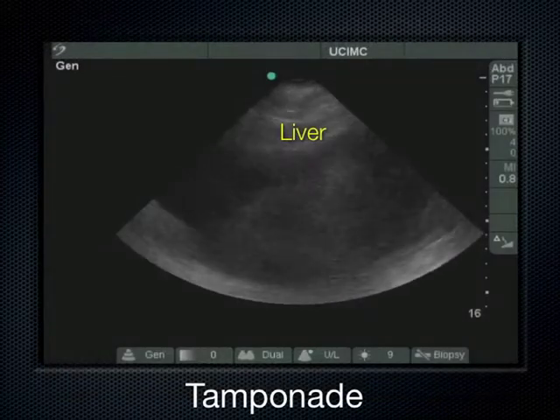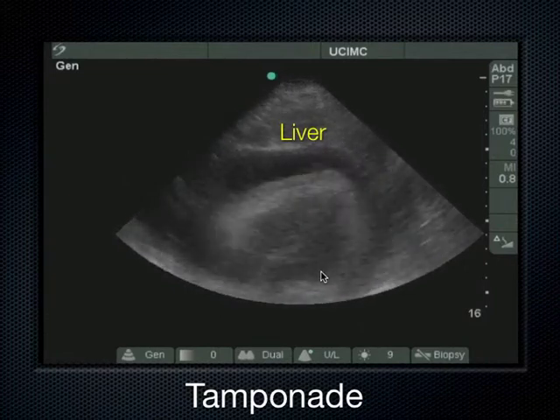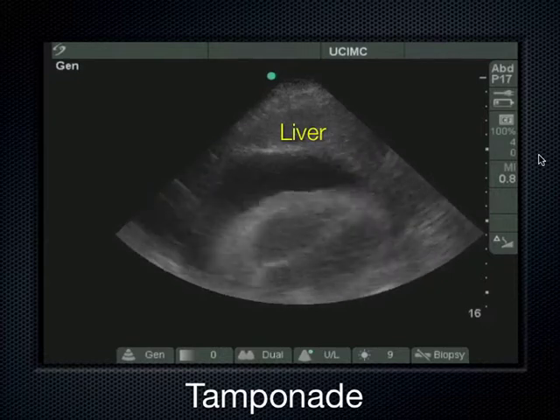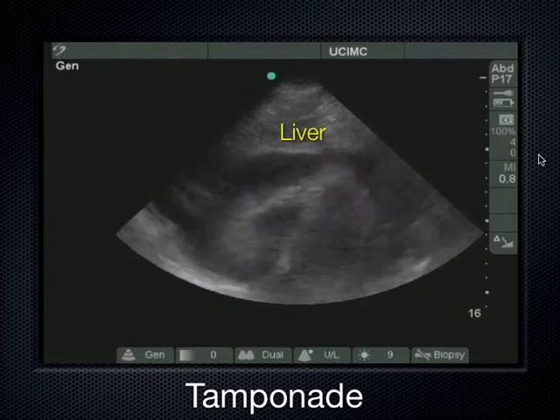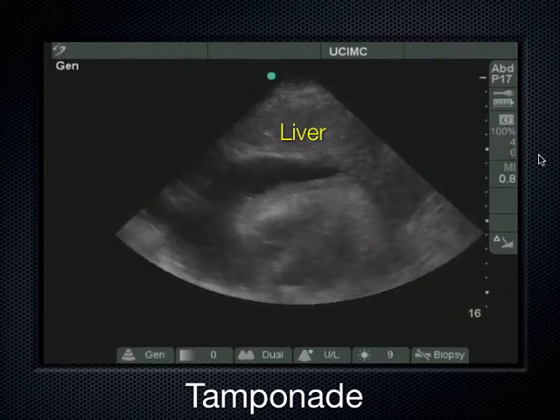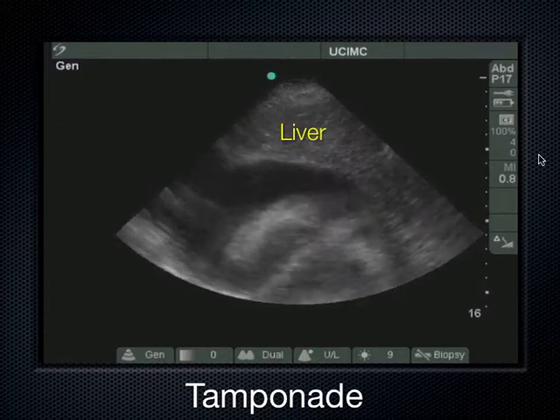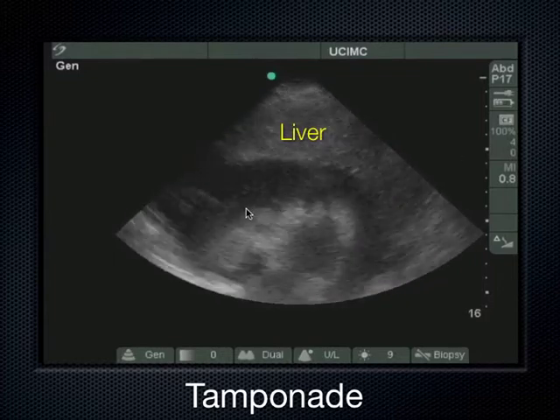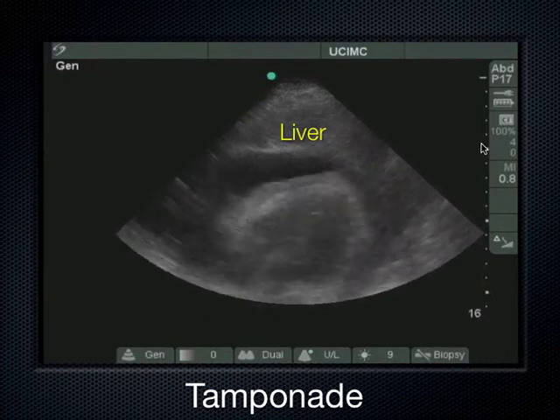All right, what do you think's going on here? Well, I already have it labeled for you as tamponade. I can see this heart swinging back and forth. That's another sign that the patient's in tamponade; you would expect to see electrical alternans here, with the heart swinging back and forth, tethered by its great vessels. This patient also has a little epicardial fat pad going on there as well. On the outside of that RV, it's kind of subtle, but there's a little fat pad there.